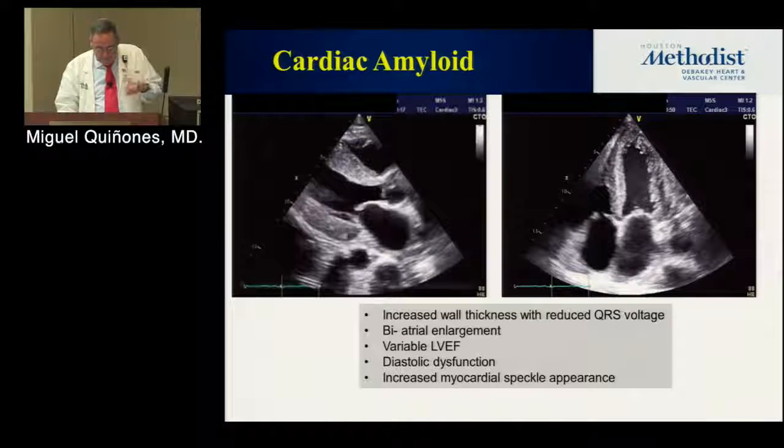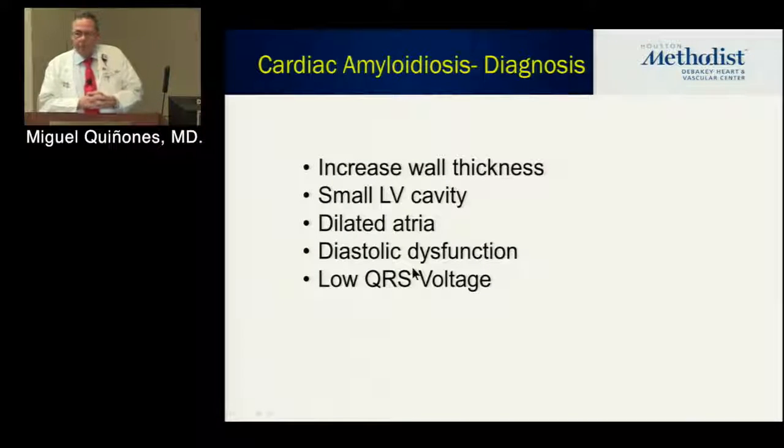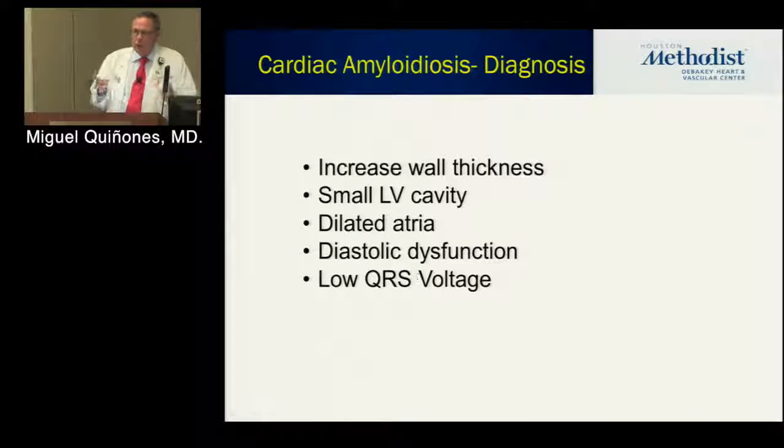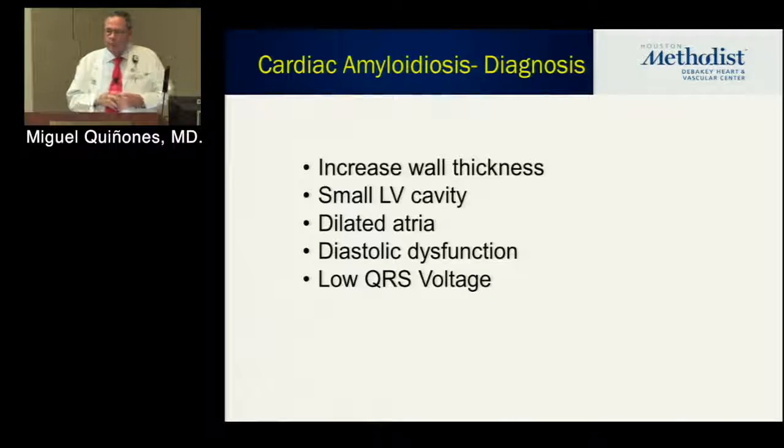So it's the EKG, when it comes into play with all of these, that makes a big difference, and frequently we make comments in our reports, consider amyloidosis, particularly if QRS voltage is low or whatever. Because that's the final thing we can use as clinicians with echo to establish a diagnosis, at least a presumed diagnosis. You're going to hear about more specific things in the CMR lab.